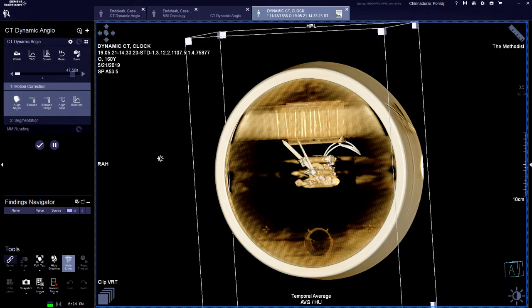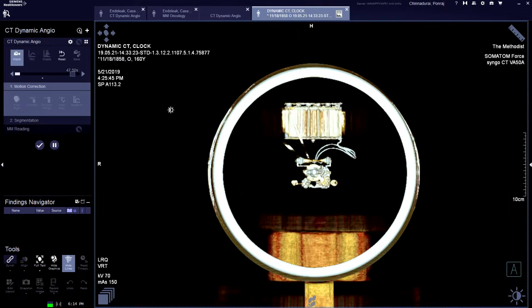Right. And again, the point here is to show that by dynamic imaging, we are not missing any critical information. So let me switch to a patient. My bias is that the cardiovascular system is incredibly dynamic. I think we're going to look back 10 years from now and go, why would you ever have static images? And you're on the forefront of trying to figure out how we send this message about the importance of this.